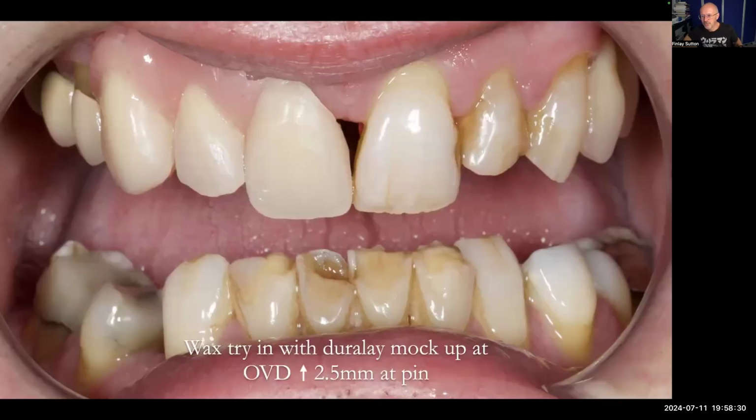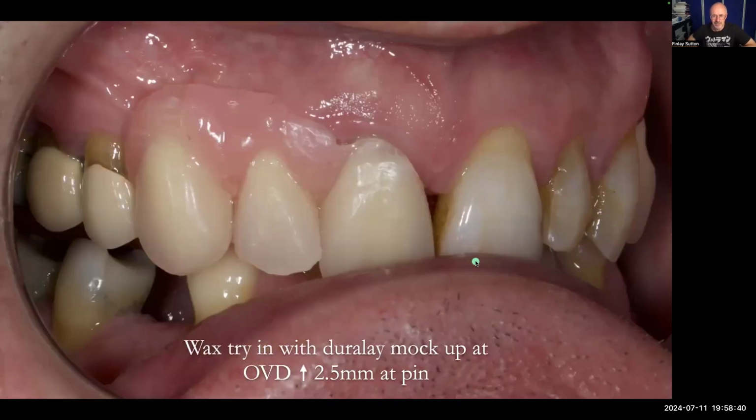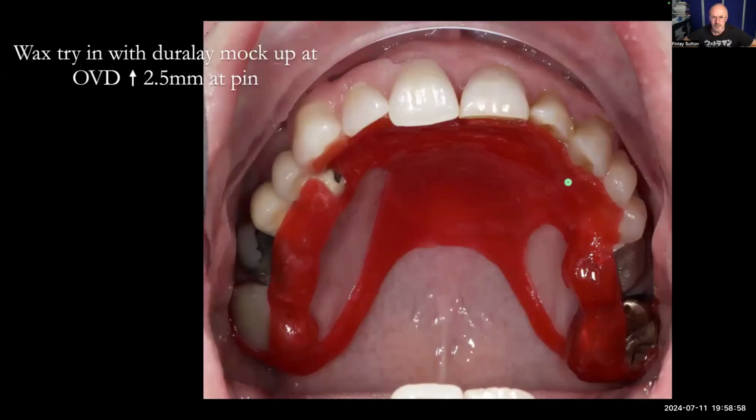So yeah, it goes into the mouth, try it in, and make sure it's lovely and even in contact, and make sure that Brian's totally happy with the aesthetics of it too. There, you look at that, you can see the missing teeth here and how it looks so much better without any pink on. If Rowan put that chunk of pink on, which often comes back, it just looks really bad. So that's it in place.